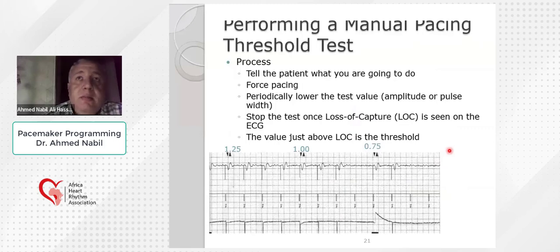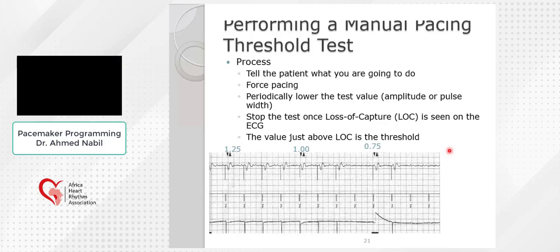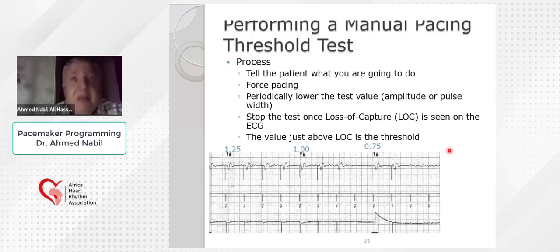Usually, some physicians start to program the patient or test at a higher rate to ensure that it is dominating over his intrinsic rhythm. So sometimes the patient can feel palpitation, and it may be bothersome for the patient. So I should inform the patient and explain the procedure that I will do.